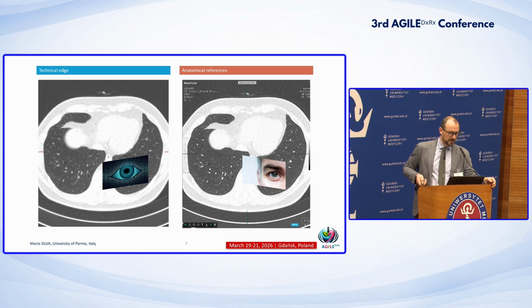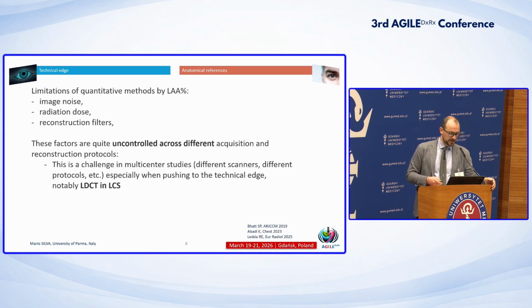This solution can be based on the very reconstruction on your CT, or some vendors, like the vendor proposing this solution, which is Coraline, and in this presentation that I'm giving, they provide a normalization of these data towards this. This is an option, but actually it includes some variables in it. So we have not much control over that, so this is something that we have to dig into.